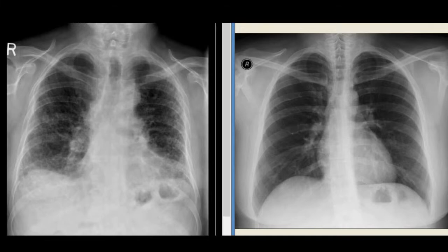Our normal chest X-ray, which we have seen several times: normal lung volume bilaterally, normal mediastinum with normal widening, normal hilar regions. The aortic arch is nicely visible; you can clearly see right and left pulmonary arteries. The aortopulmonary window is clearly visible, right and left heart borders are clearly visible, and there is normal lung parenchyma with a usual vascular pattern.